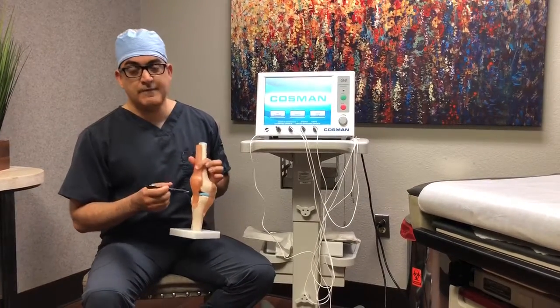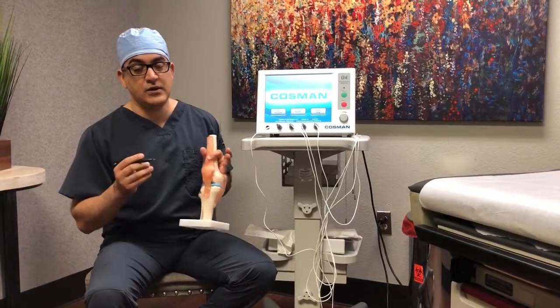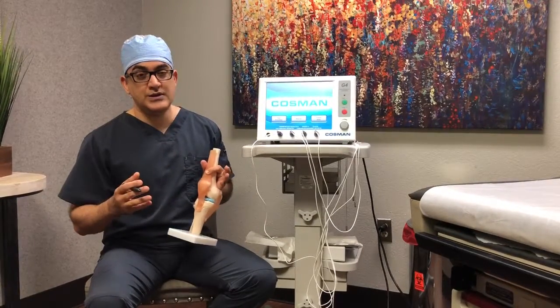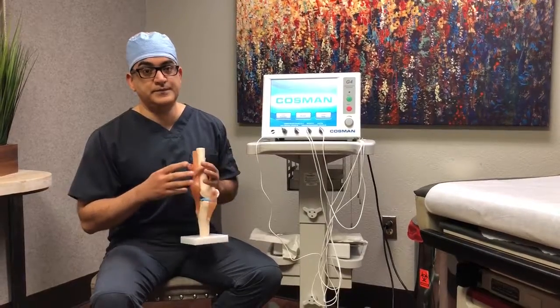...we will turn on the machine. The machine then heats up the tip of the needles to 80 degrees Celsius for a minute and a half, creating small lesions along the path of the genicular nerves — essentially cutting the pain wires of the knee.